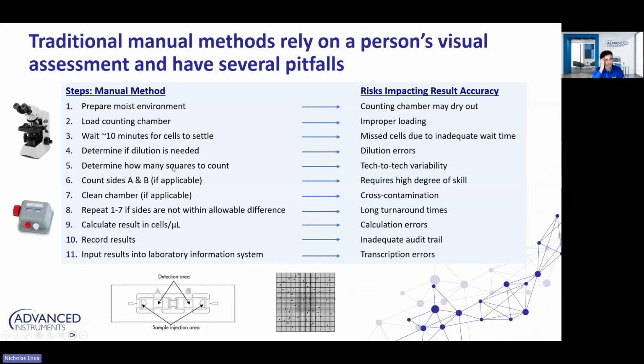So traditionally, and I'm sure what most of you are used to when you're analyzing a CSF count, is this manual hemocytometer method. Now, I'm not going to outline all the separate steps of this, but this process is relatively tedious. It's a very long workflow. It requires step-by-step demand from the operator, the clinician that's ultimately doing this test, right? And on average, this can take around 30, if you're someone like me who's a little bit on the slower end, 30 to 45 minutes.